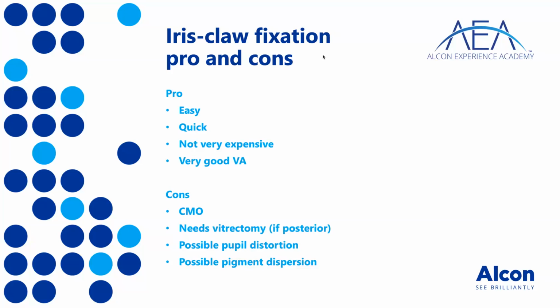I can't quite remember what the exact situation was, and eventually he ended up having it removed, because even if it was not massive, this small amount of pigment dispersion was enough to create him a problem. So let's say this was the biggest issue that I've had over years and years of implanting this lens, was removing one for this specific reason.